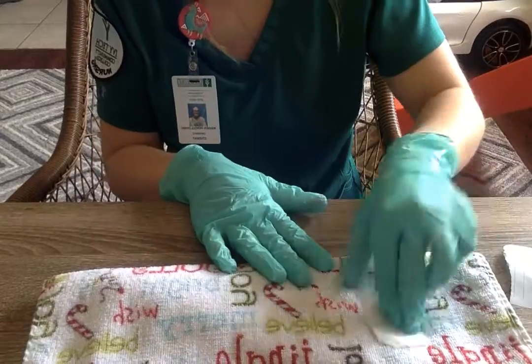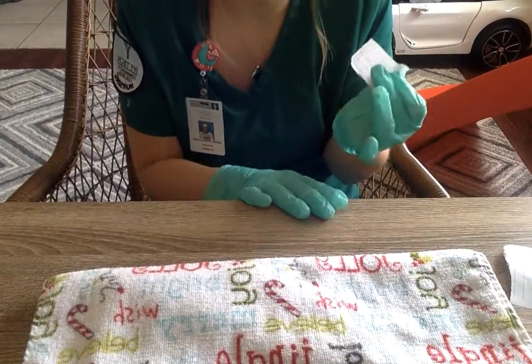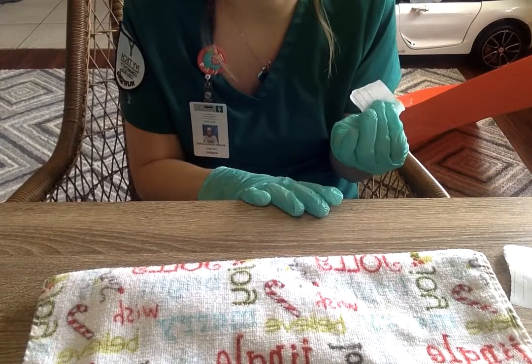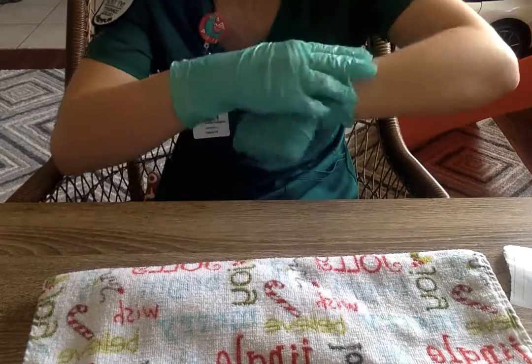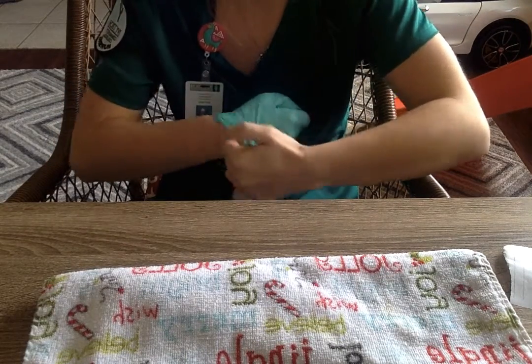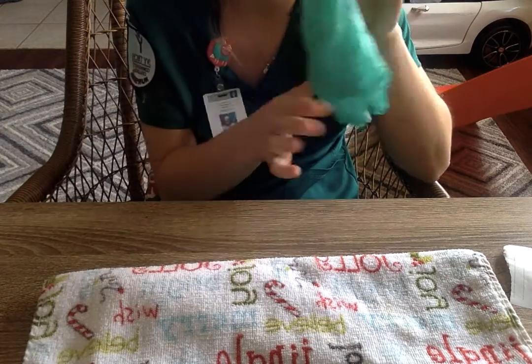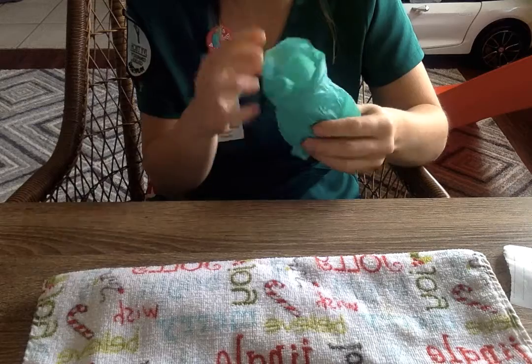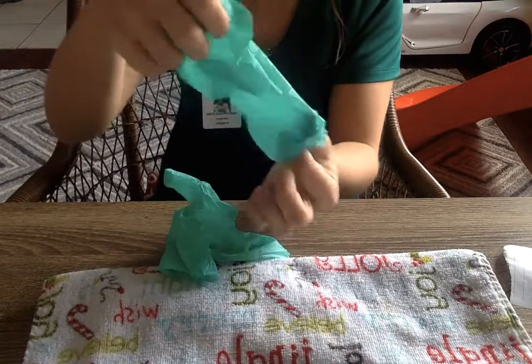Oh, I totally forgot. So when you take it off, like so, wherever per policy procedures, but for the sake of this video, we are going to dispose of our patch in our hand, and we're going to take our gloves off, like so, and discard of it like that. So the old patch is inside of here. But just bear with me, because these are my only gloves, and I have to reuse them.